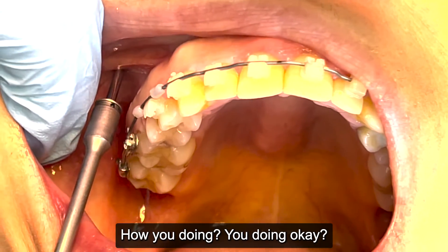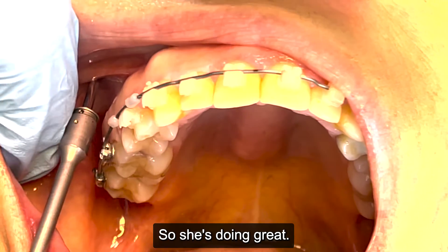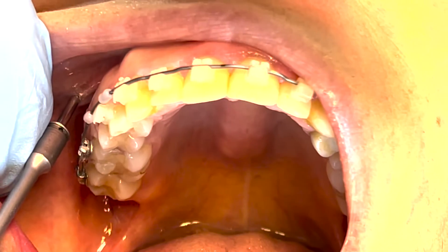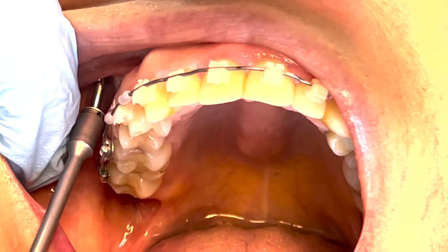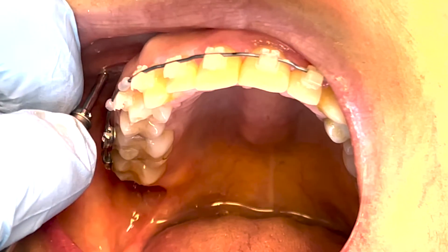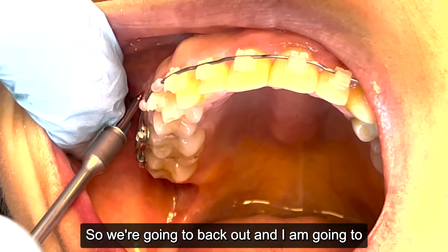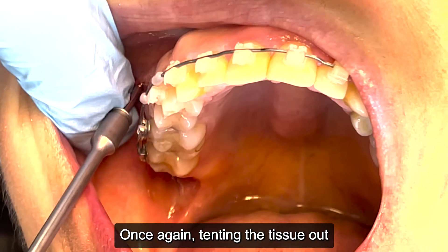The patient is doing okay. I was a little bit too mesial there, so I'm going to back out. I slid off the mesial and kind of felt it as I did that, so we're going to back out and go right in here once again, tenting the tissue out.